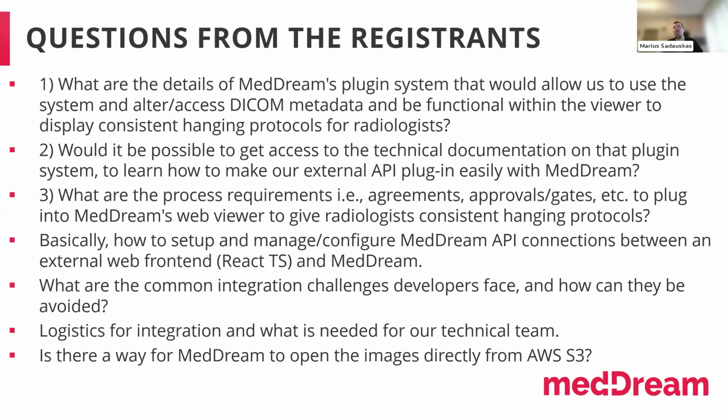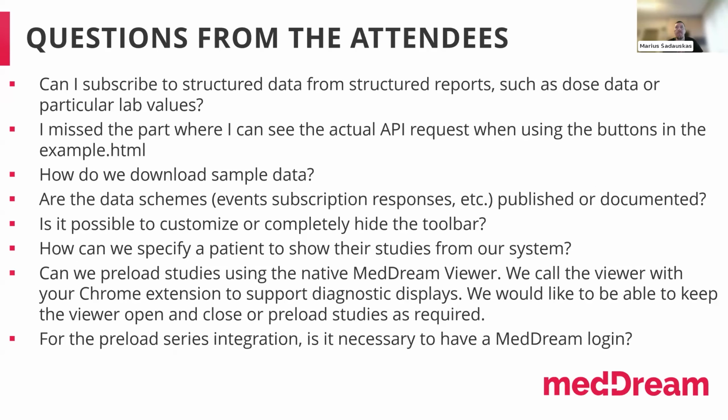However, you would need to create a service which would return the JSON metadata information, which metadata we need. It is described in our install manual, and you would need to provide this metadata and the direct links to the DICOM files from the S3 buckets. Then MedDream will take these images directly from S3 and display them.